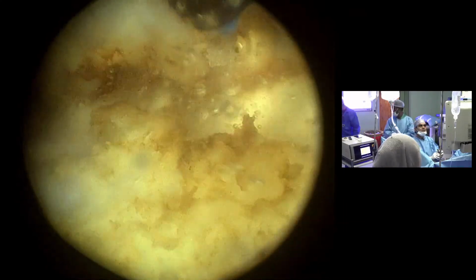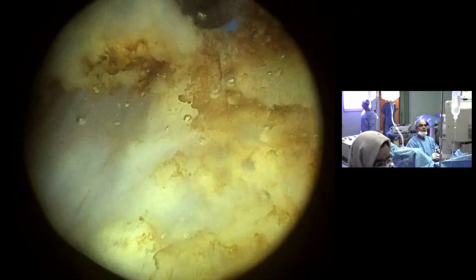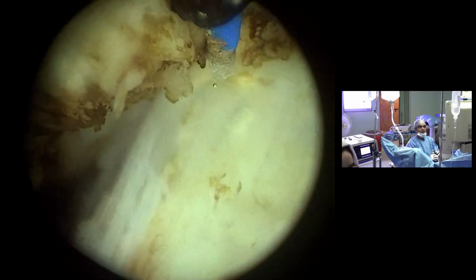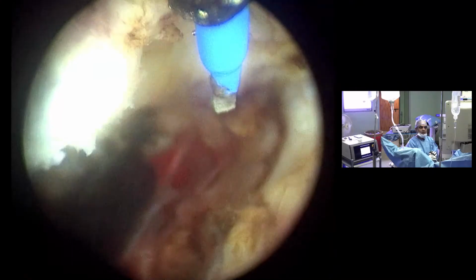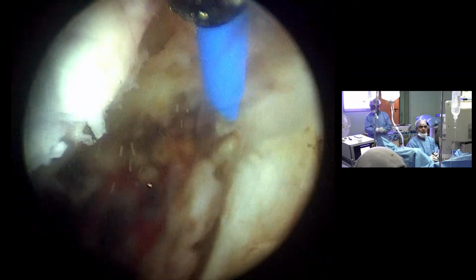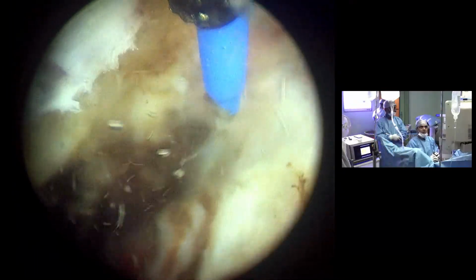Thank you, sir. Dr. Ashish, can you tell the audience the ways to manage bleeding in these lasers? Usually I never face a bleeding issue with this thulium, but sometimes if you go too deep, then yes, you may encounter those bleeders. So this is what we are encountering at that point of time. Usually, it doesn't need a defocus. It has a dual pedal, so you can just fire it, just like a coagulation, and it will stop.